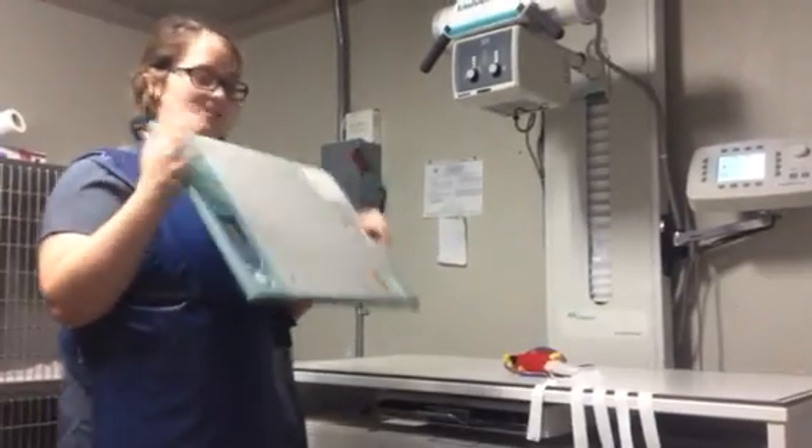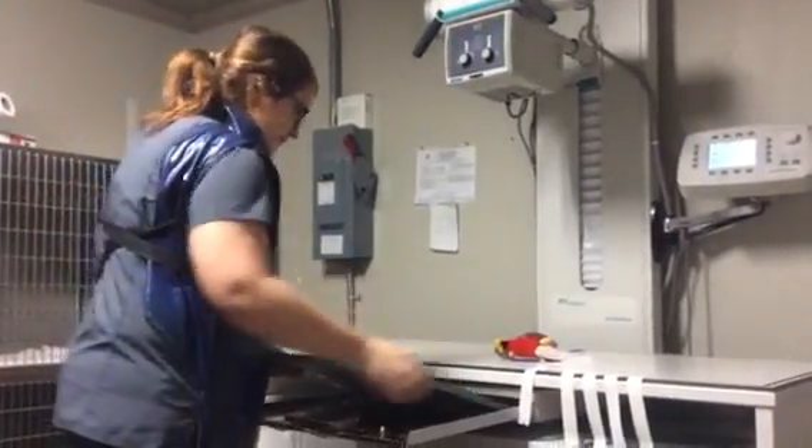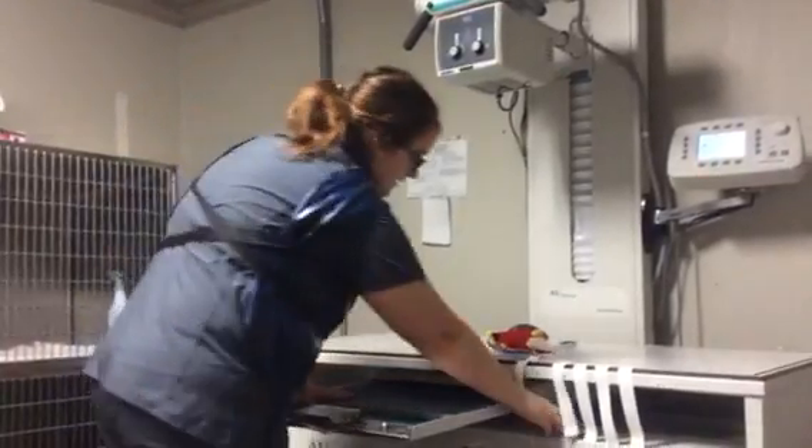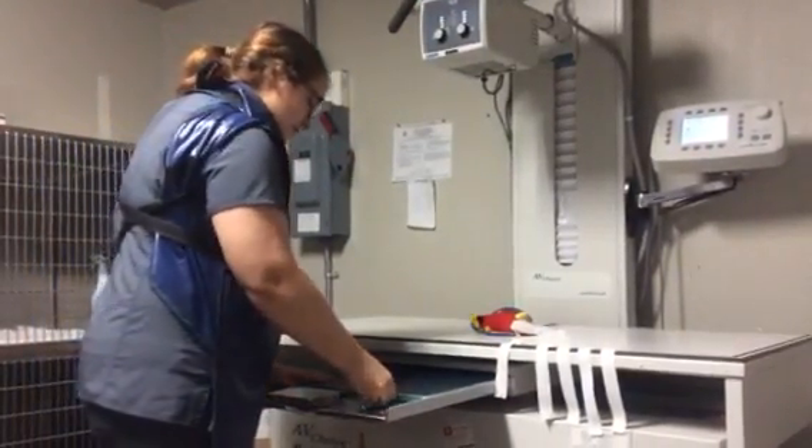Setting up for a bird x-ray — this is our cassette. It goes from here. That is a marker for right and left. That would be the right.